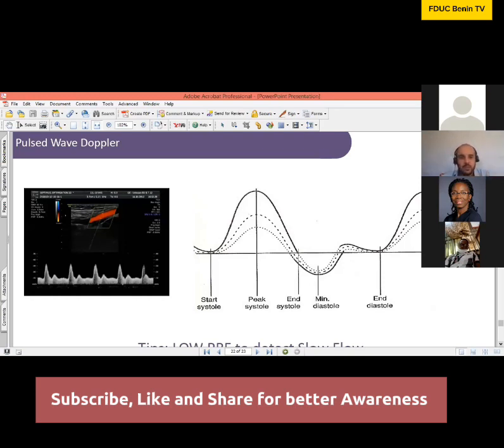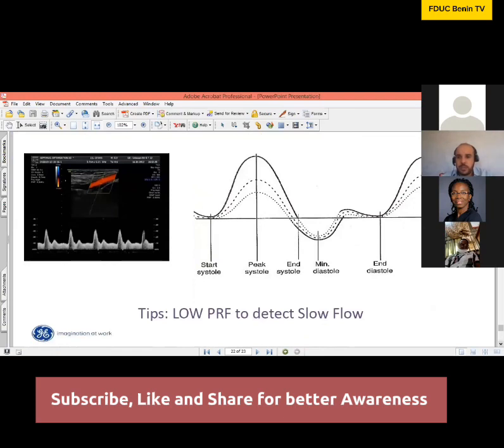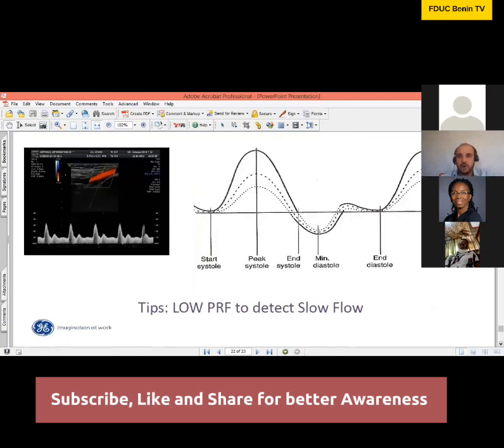So even when you are on the pulsed wave Doppler, once you launch your pulsed wave Doppler, just reduce your PRF, and you will improve the sensitivity of your Doppler. You see, very simple, but straightforward. And this is how you will optimize and improve the sensitivity of your color Doppler.